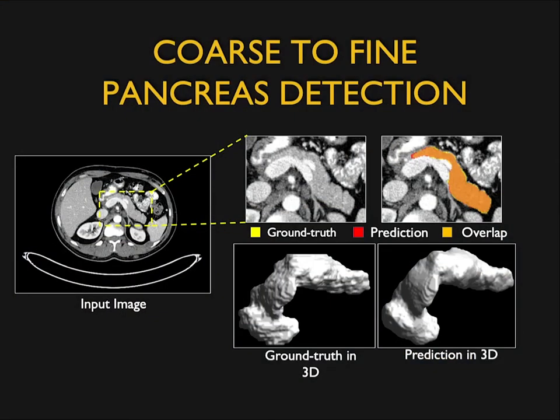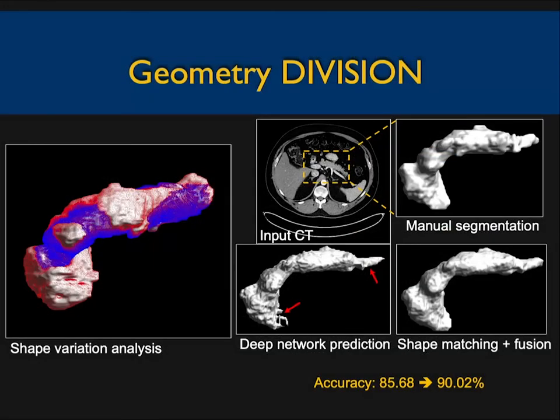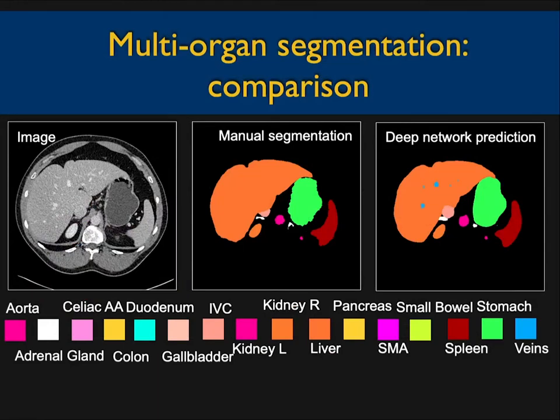We've developed specific algorithms. Alan Yuille and his team developed algorithms, geometry, multi-organ segmentation. These are going to change how we practice. There is no doubt about it. Is it a year away? Is it 5 years away? Somewhere in between. But it's coming, and it should be awesome.